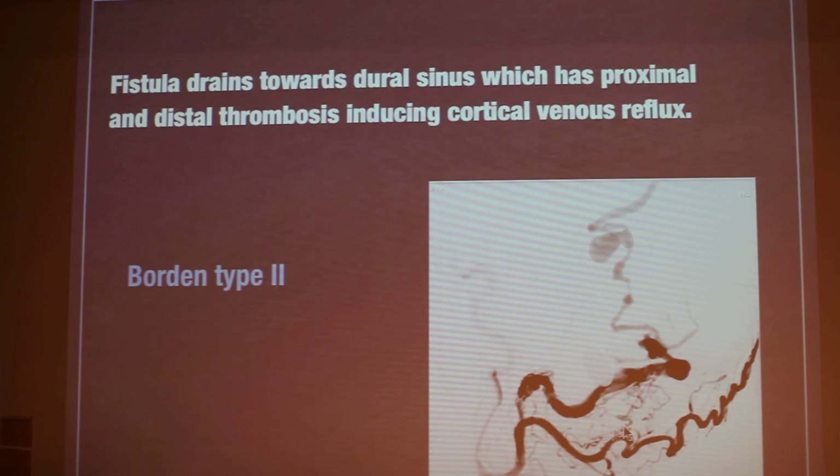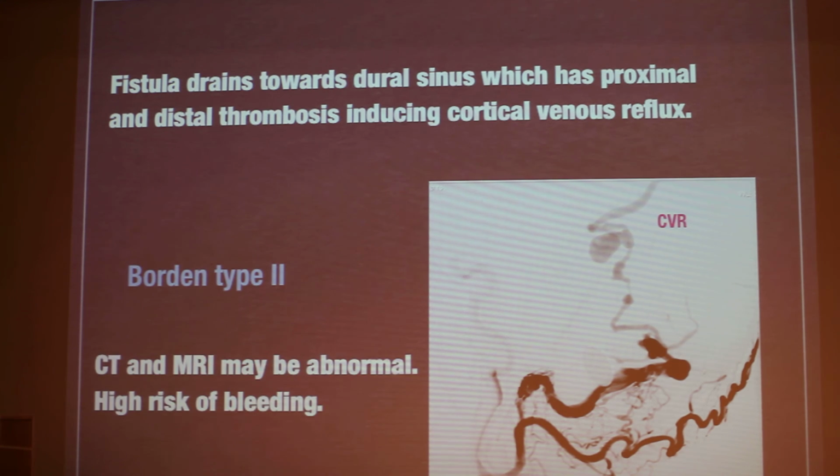It's almost the same story. This is the occipital artery. You have arteries going here to the transverse sinus, but here the transverse sinus is occluded. So all the fistula drains into this terribly abnormal venous structure, stenotic, ectatic, with a varix here, an aneurysm, that goes straight into the brain. This is a very risky situation, and those lesions you can usually recognize on the CT and MRI.